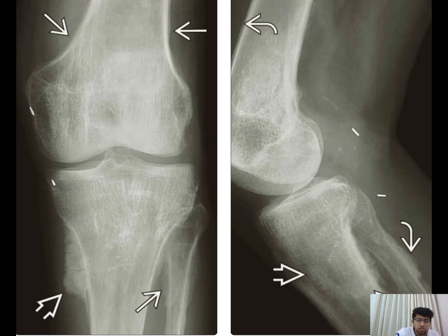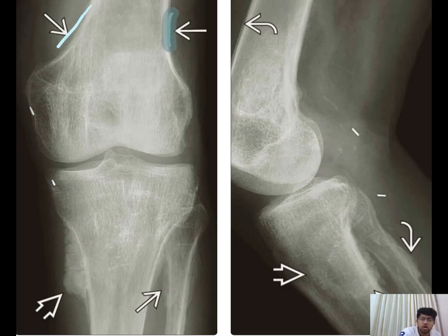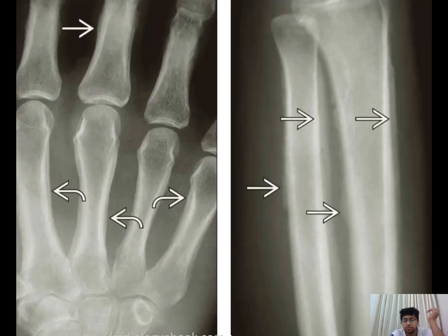In this image, we can see some exuberant periosteal reaction both in the tibia and fibula, and also in the femur — periosteal reaction at the distal end of the femur — which is a case of hypertrophic osteoarthropathy. In this next image, we can see periosteal reaction in the metaphyseal region.